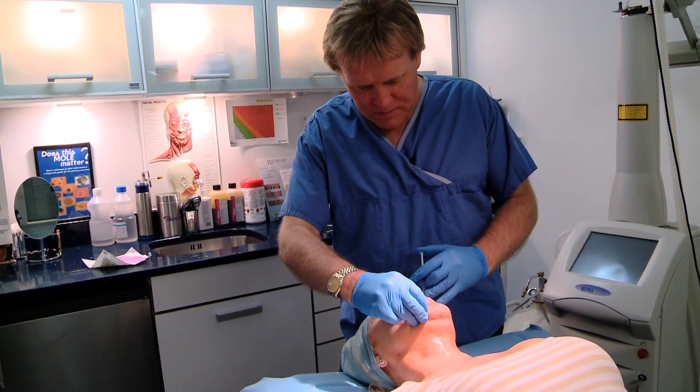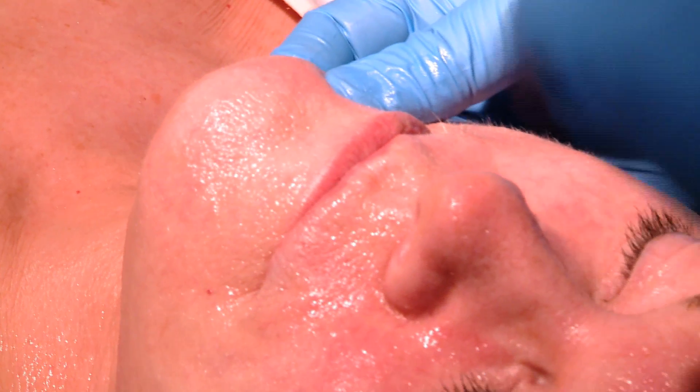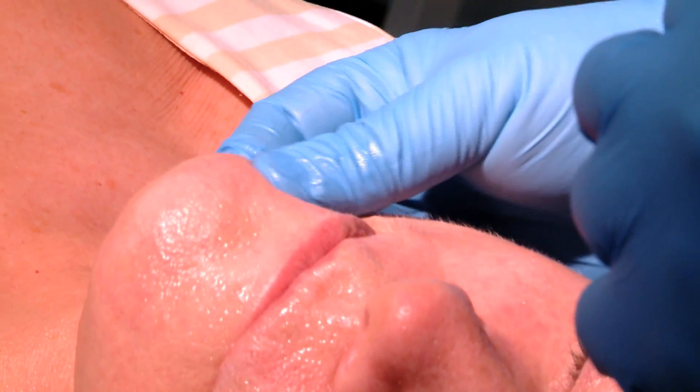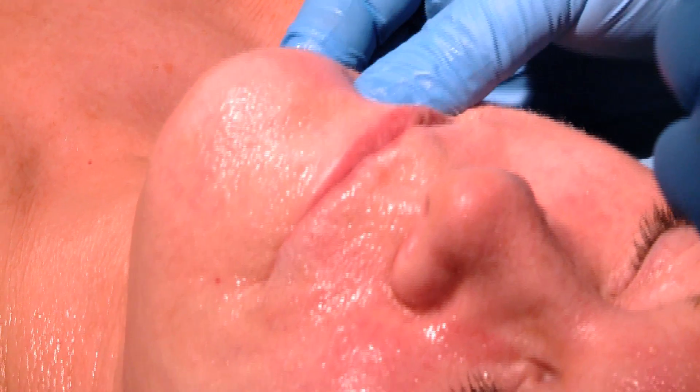On the bottom, it's the fifth tooth across — this little frenulum is where we're aiming for. You can leave the buccal cavity open to give the injection, and I find that sometimes if you let it close against the needle, you tend to get a better distribution of the anesthesia over the nerve.